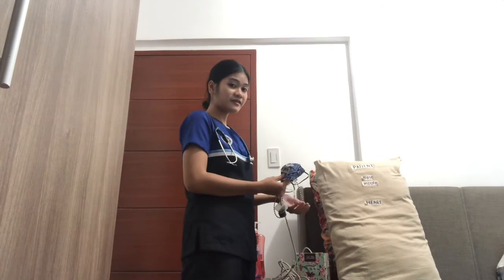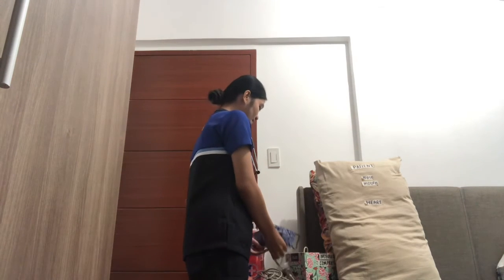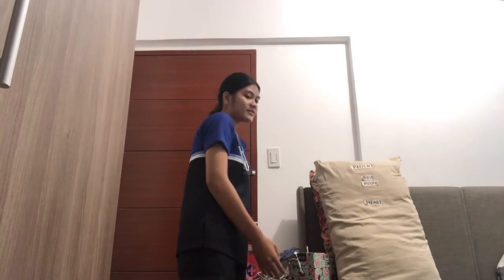After we turn off the nebulization compressor, we will now pull out the plug of the nebulizer compressor from the power source. And after that, if the secretion increases, assess the patient for suction. Since our patient has just a normal secretion, we will now proceed to assess the patient's pertinent assessment findings, just like monitoring the patient's heart rate.